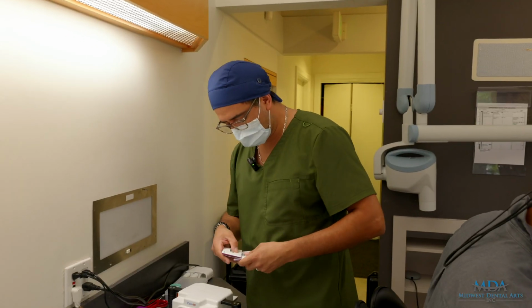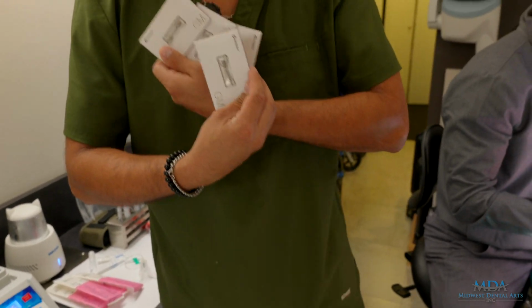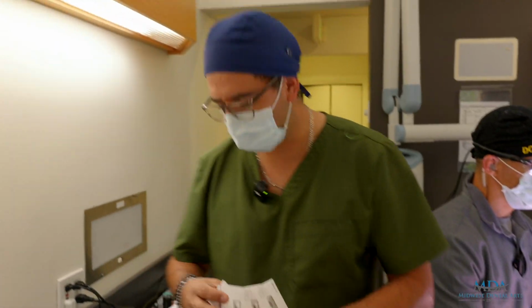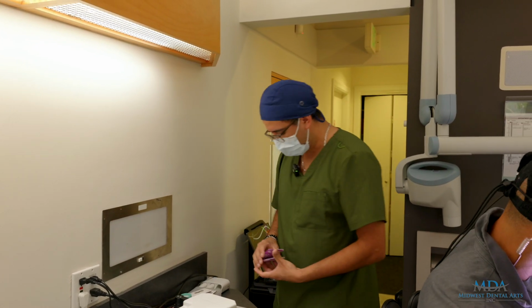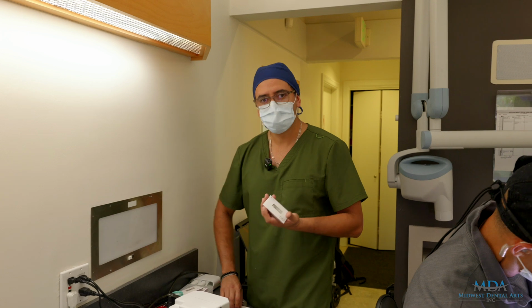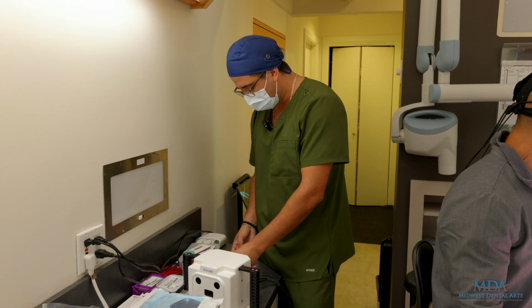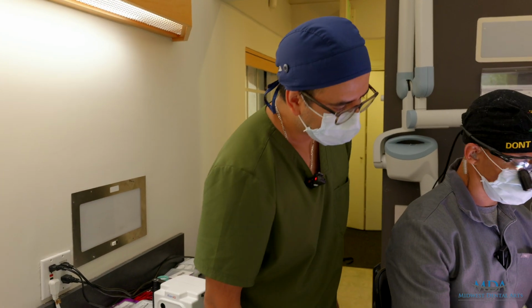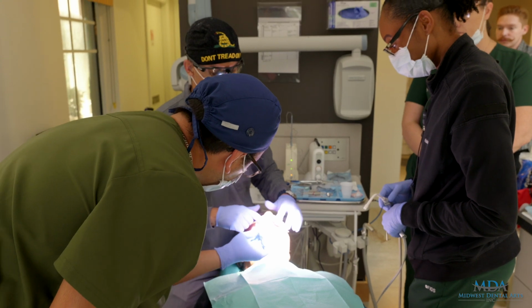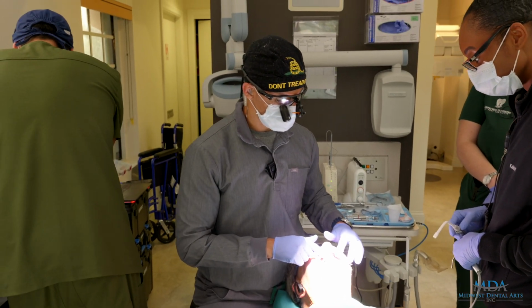So in this case with Dr. V, we chose a bunch of different MUAs because we can't really decide until we really see the patient and how we have to angle correct. So besides just getting four, we have maybe 10 or 12 different options. But I think we're gonna stick with the most conventional where that implant is, just to see the angulation. I think that one's gonna be good as a straight. That's what we decided, correct?